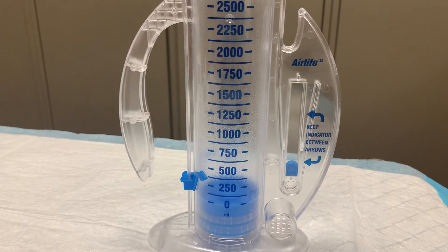Depending on the order and reason for the spirometer, sometimes the physician will give the patient a goal volume to attempt to reach. Other times the patient may just be encouraged to continue to improve their performance. On the right side of the device is a small blue tab encased in a column. Markings around the column show the patient where they should keep the tab floating during inspiration.